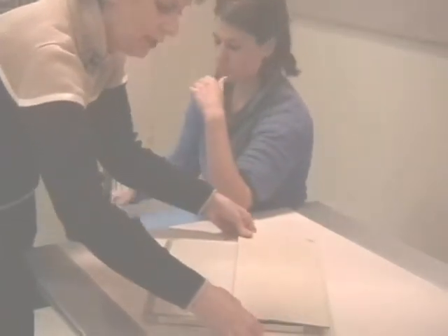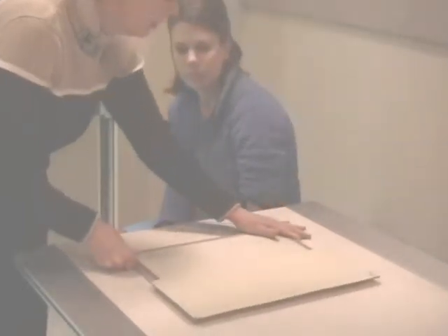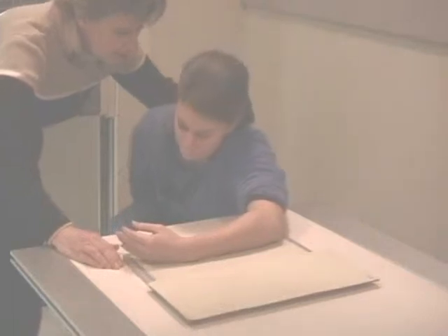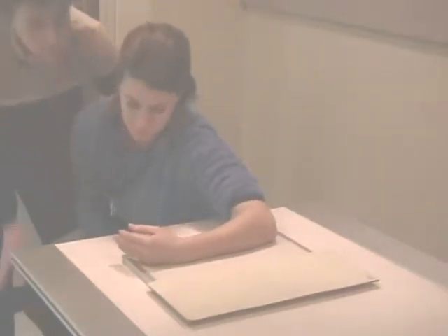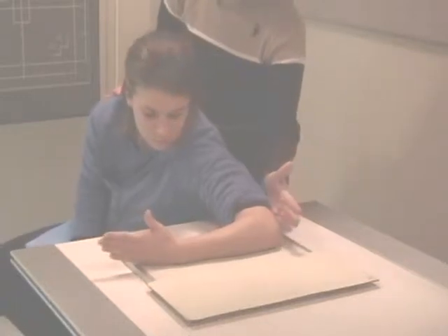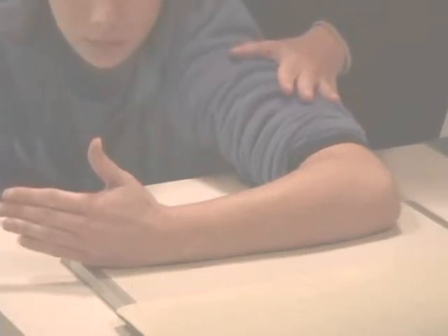Protect the first half of our cassette. We're going to turn the cassette, and now I have my patient put their forearm out there, and I get the elbow. Let's come this way. There we go. I get the elbow at a 90-degree flexion, and I want the humerus flat, so the patient either has to scoot their chair back or they have to lean into the table. Get your patient comfortable. No knees underneath the tabletop. Okay.